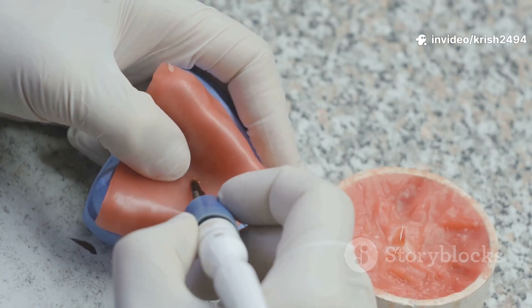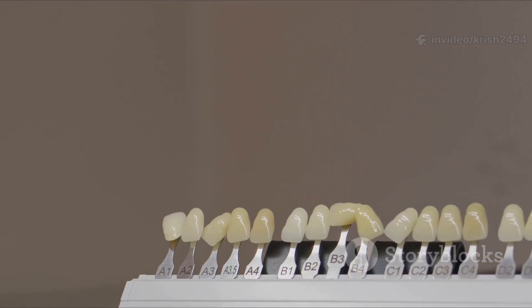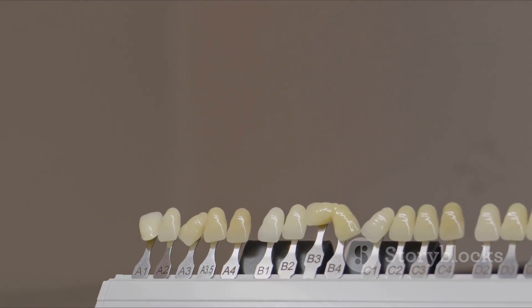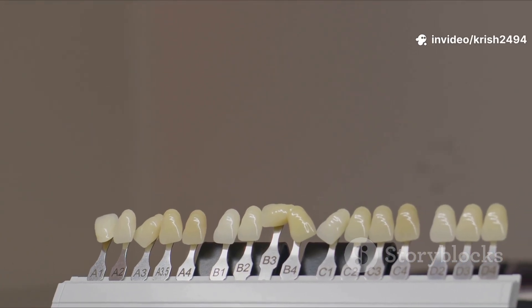Next up is custom tray fabrication. The lab pours your initial impression into dental stone to make a diagnostic cast. Then they use this cast to craft custom trays out of acrylic resin. These trays are designed just for you and will help capture all the fine details of your mouth.